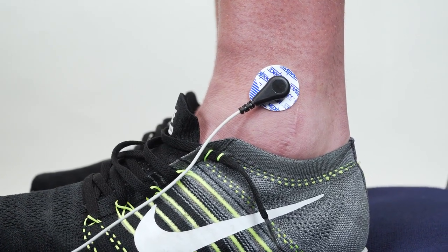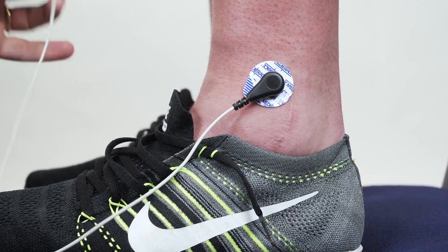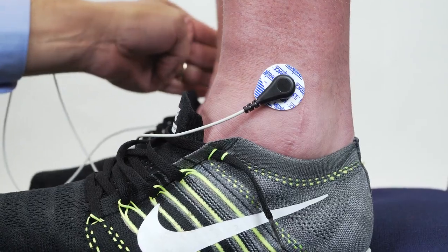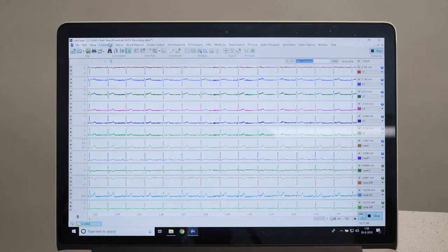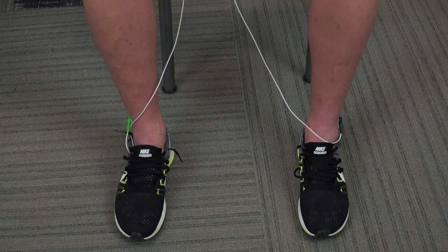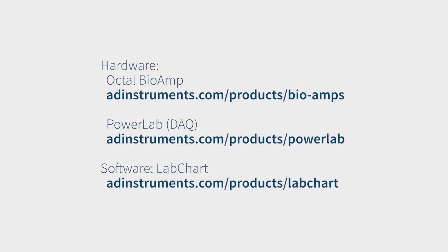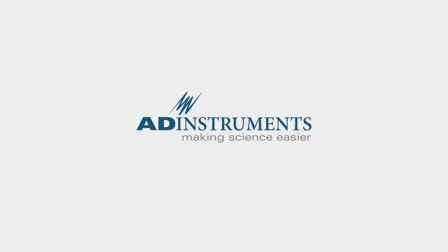Lastly we can stick on the common, which goes to the ground input on the octal bioamp. Stick that on the right leg. An important part of getting really clean ECG data is to have the subject either lying down or sitting very relaxed in a chair, as EMG can cause a lot of noise artifacts in your signal.